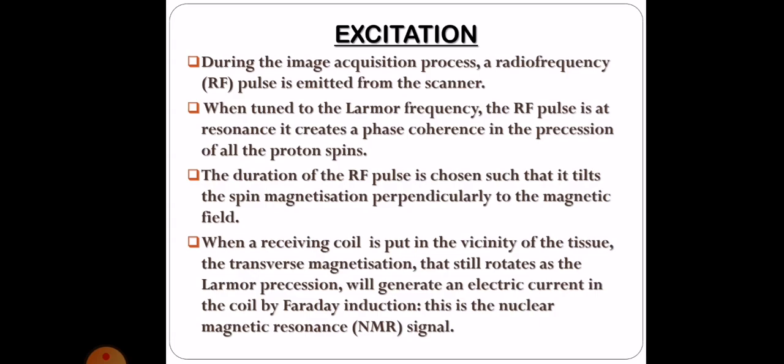With a flip angle of 90 degrees, the nuclei are given sufficient energy so that the longitudinal net magnetic vector is completely transferred into a transverse NMV that rotates in the transverse plane at the Larmor frequency. So the final point is that the result of resonance is that the magnetic moments of the hydrogen nuclei within the transverse net magnetic vector move into phase with each other.